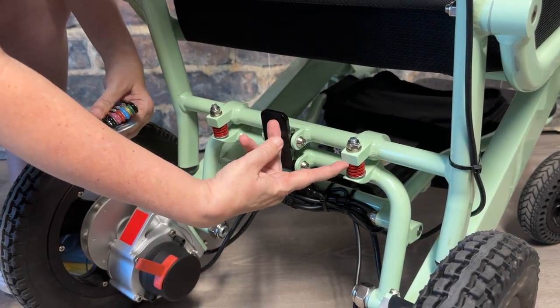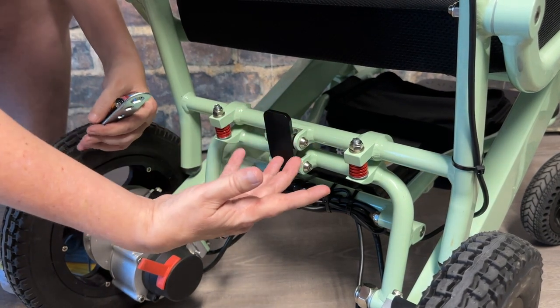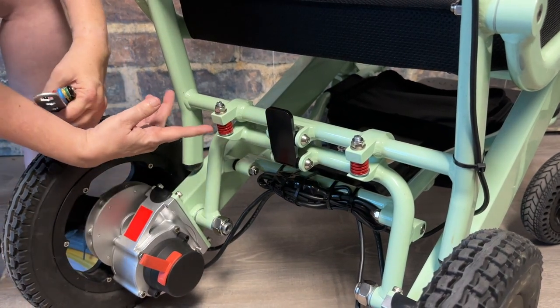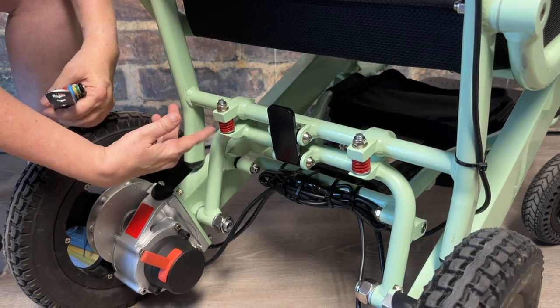Next are the red seat springs — spot check these. The tension of the red spring should fill the gap between the frame pieces. You should not have a gap under the spring to the bottom frame piece.